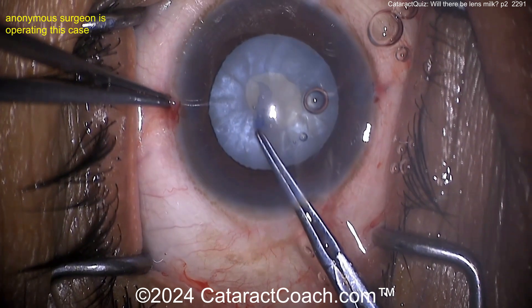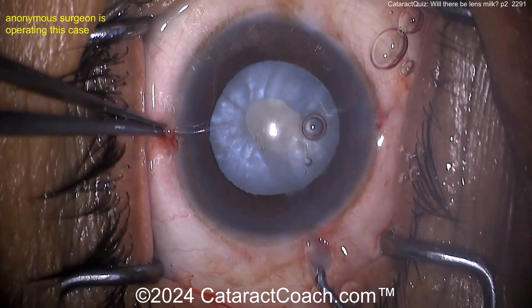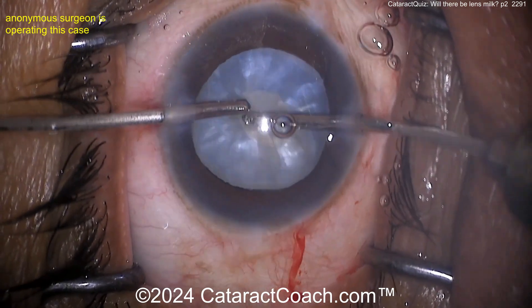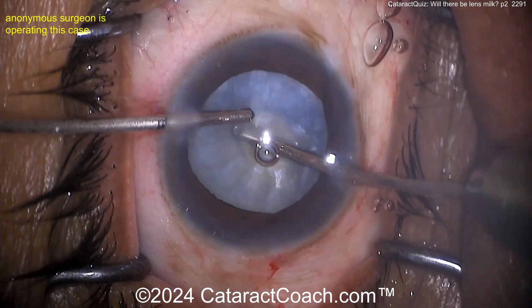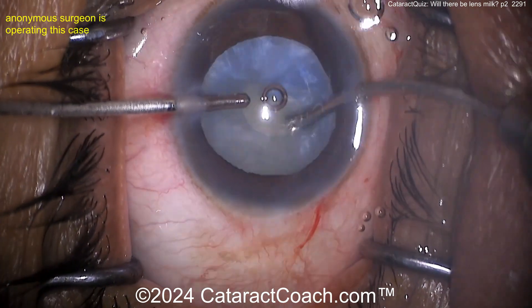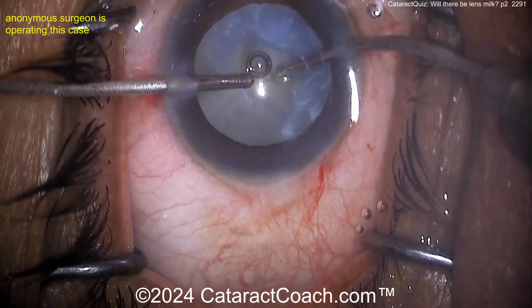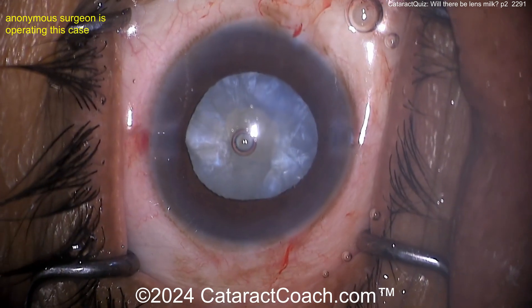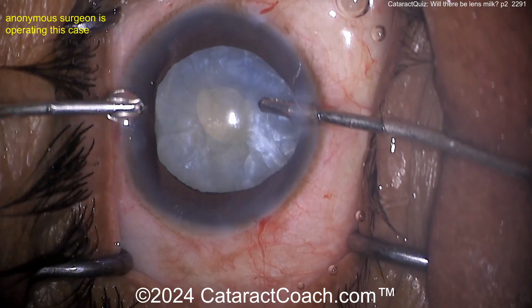This is not a championship level of lens milk coming out, but I bet there's going to be plenty. Now by manual I/A — look at that, going with the I/A probe to help evacuate the fluid. I like that idea — evacuate the fluid from the capsule bag. Look at that rotation of the lens too, getting all that material out.